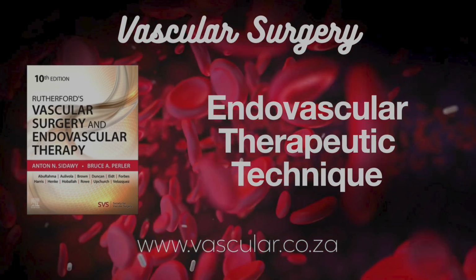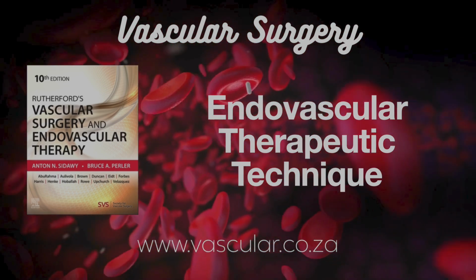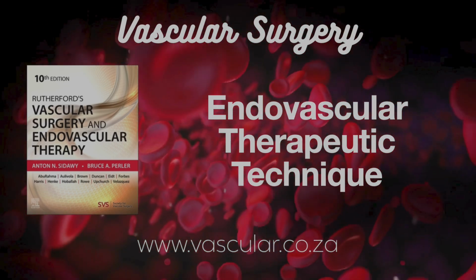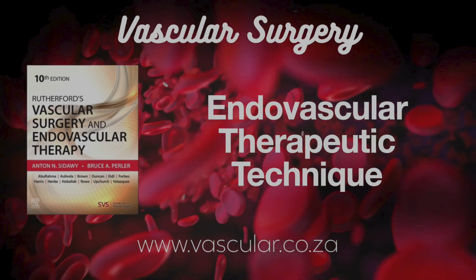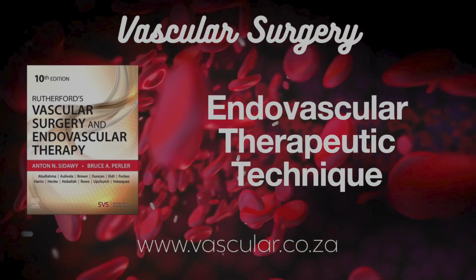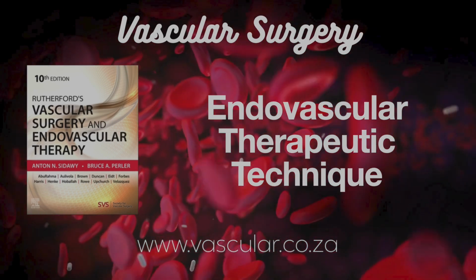They're not covered. No, they're uncovered, self-expanding stents made of cobalt alloy. The key is their structure. Multiple layers, creating a very high porosity, about 65%. This unique design changes the blood flow dynamics within the aneurysm sac. How does that help? It encourages thrombus, blood clot, to form and fill the aneurysm sac, essentially sealing it off from within, while the porosity aims to let blood continue flowing through adjacent side branches. It's a flow modulation strategy, not exclusion like a covered stent.